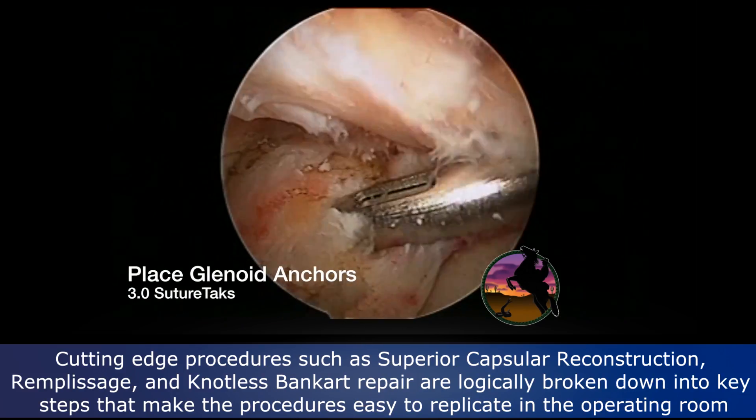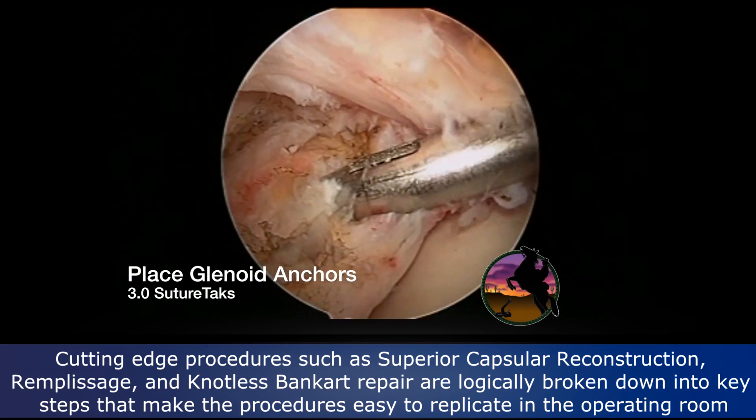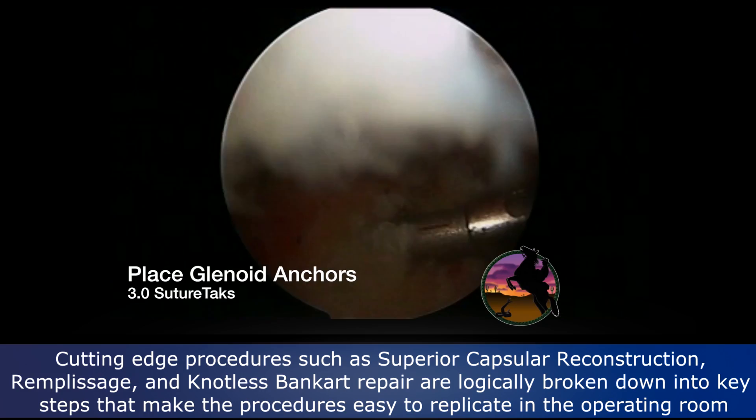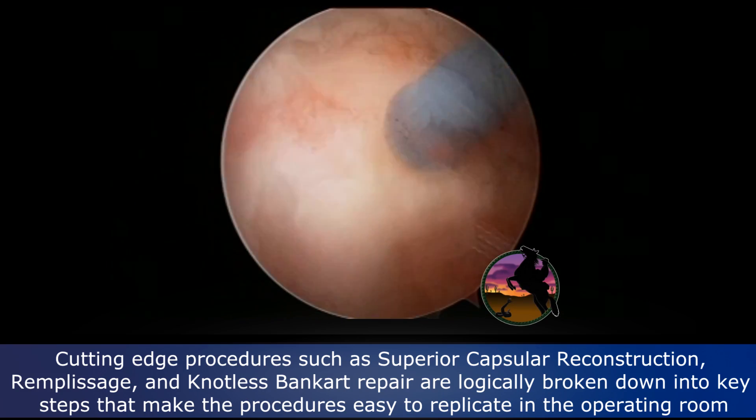We place an anterior anchor on the glenoid. These are 3 mm suture tacks. And now you see our anchors front and back.